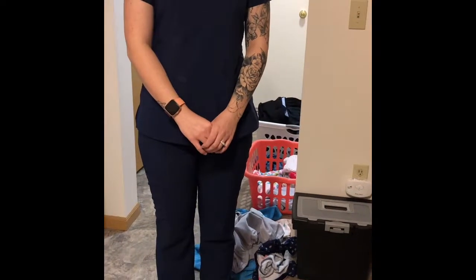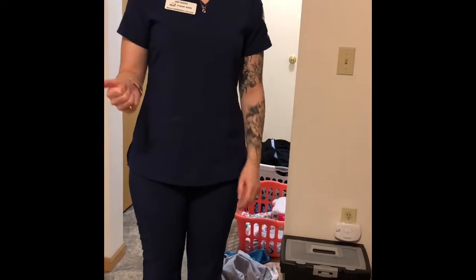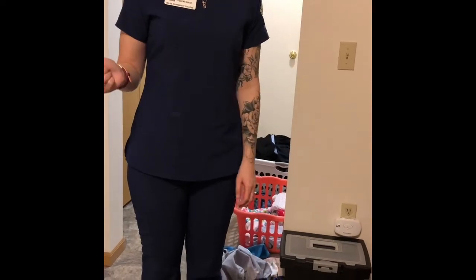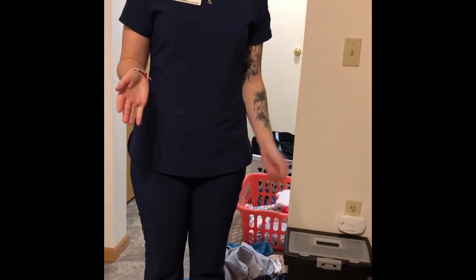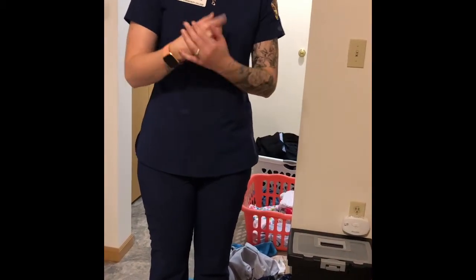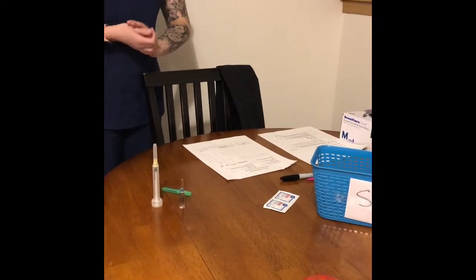You always want to use the 6 rights of medication administration. You want to make sure you have the right patient, the right medication, the right dose, the right time, the right route, and the right documentation. So I'm going to wash my hands. I'm going to come and look at my physician orders and my medication administration record for my patient Skip Rocker.